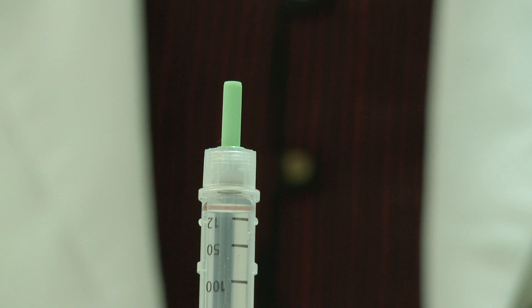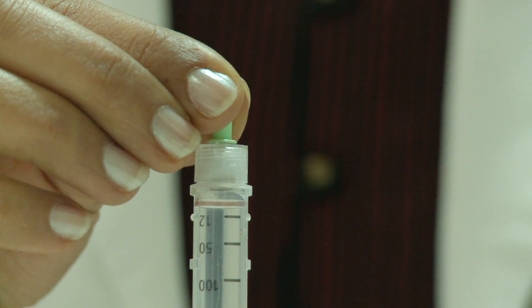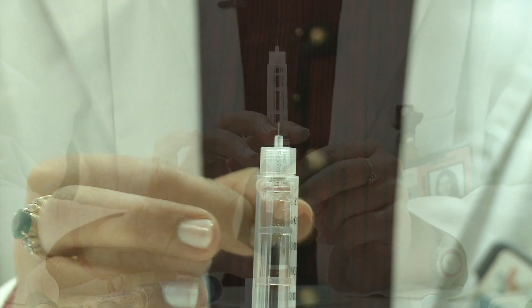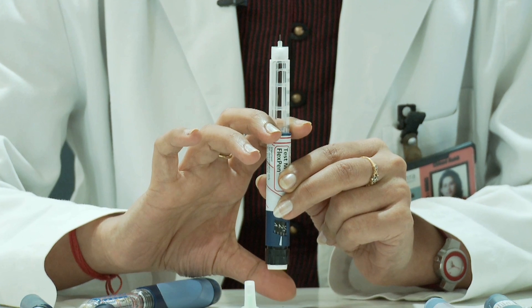After dialing, hold the pen vertically with the needle facing upwards. Remove the green cap. Tap the pen and press the dose dialer until you see drops of insulin on the needle tip.